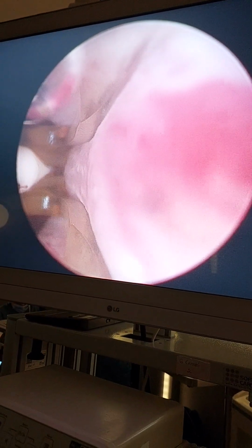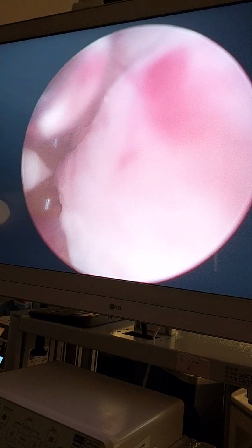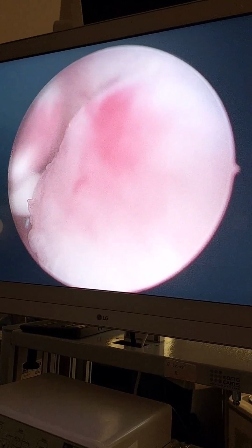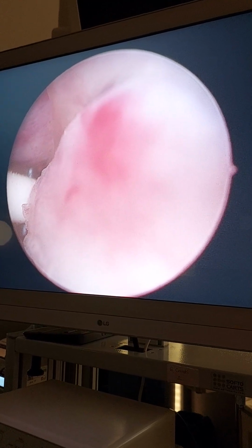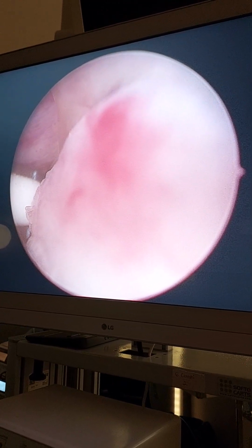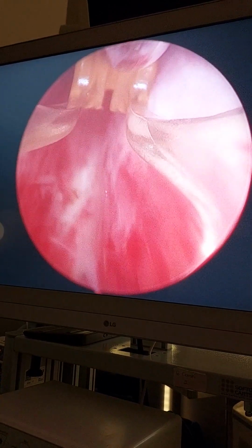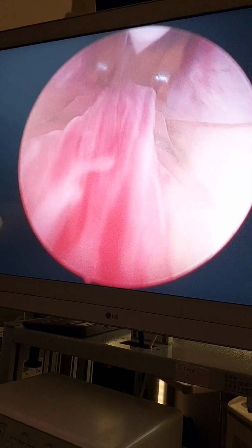Let me see what I will do. Okay, this is the left lobe. I can do it here. This is half a centimeter, this is 1 centimeter. And yeah, I am putting it here, giving the steam. 9 seconds, we sent the steam inside. Let's see what happened. Yeah, there is some opening now. And some whitish tissues here.